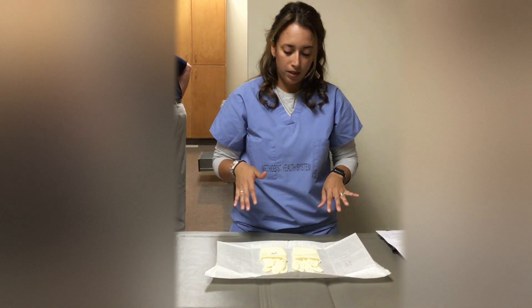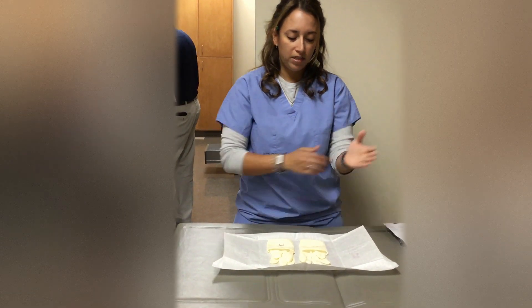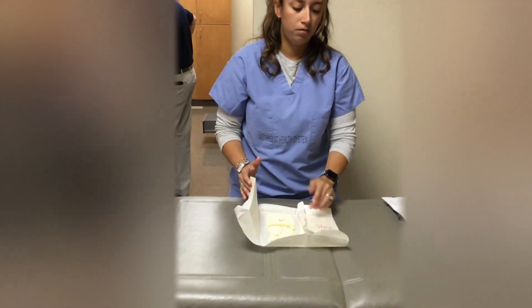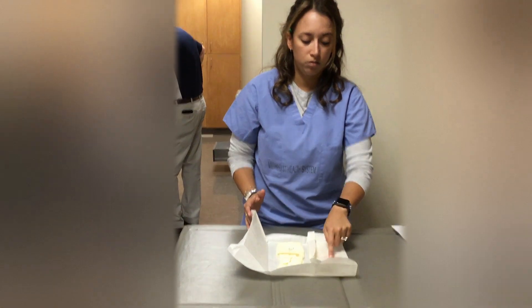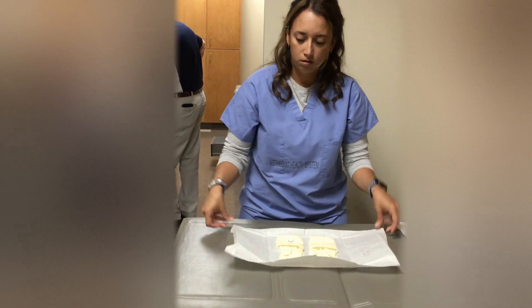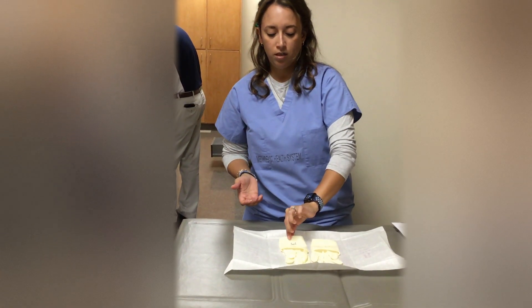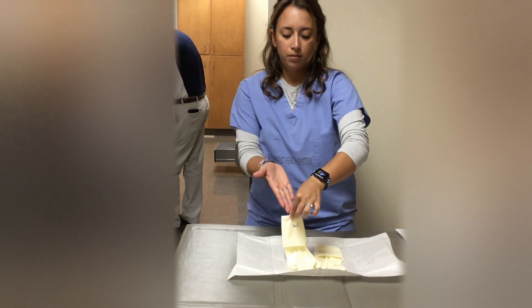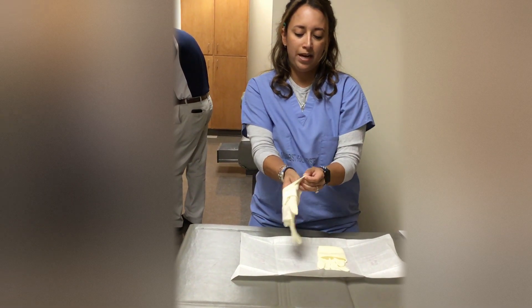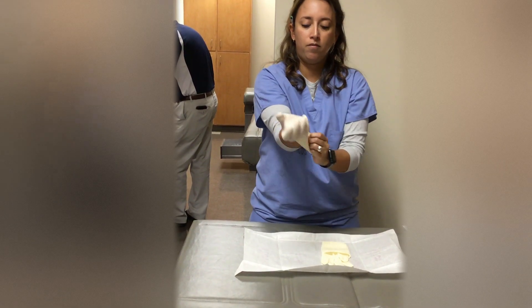Now I'm going to get the glove on. I'm going to use my non-dominant hand to grab the opposite hand. They should be facing you — just like the print is going to be facing you — so if you can read it, it's the right orientation. I'm going to grab the edge here and lift up, inserting my dominant hand as I'm pulling away from the glove and keeping my hand away from my body.